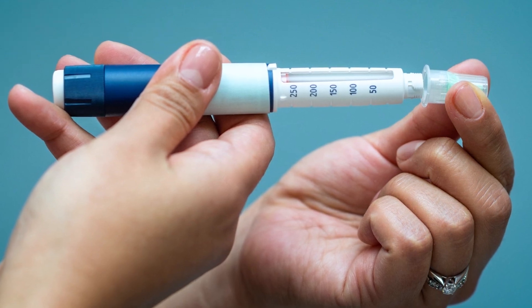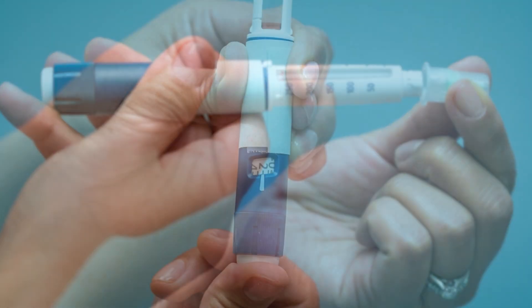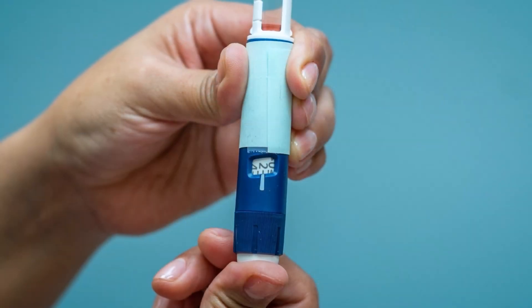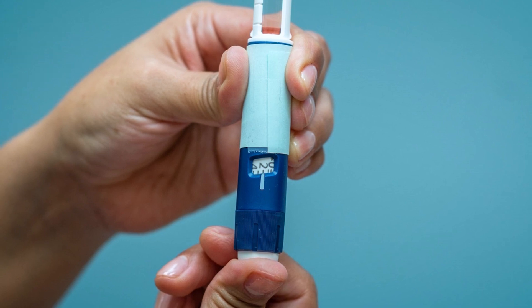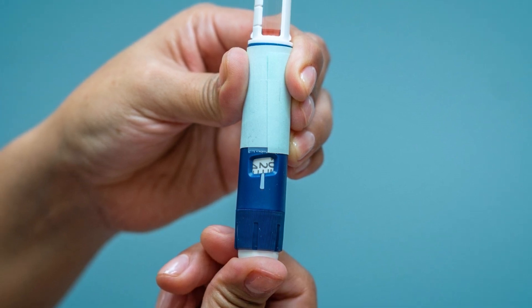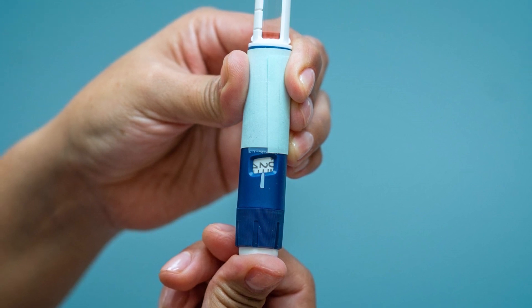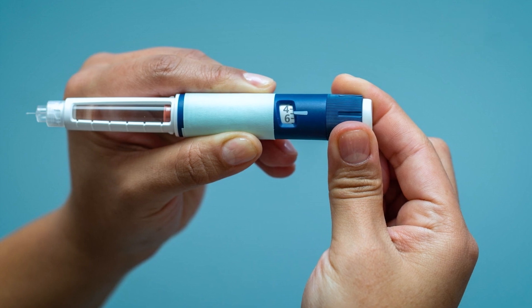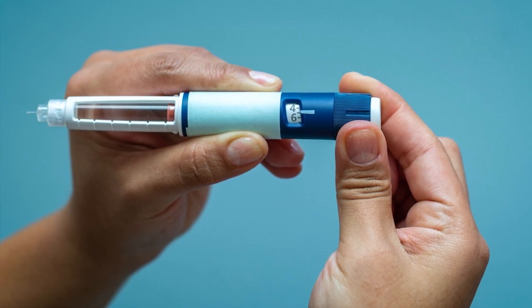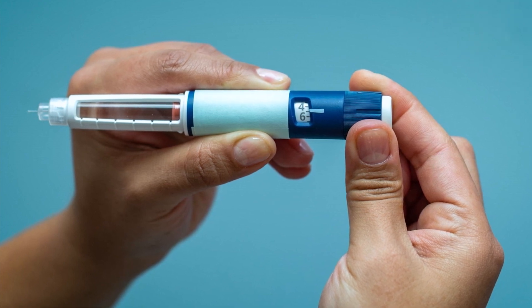Carefully remove the clear outer needle cover and inner needle cover to expose the needle. Step 4: Check the flow of insulin by dialing up to two units and pressing down on the back of the pen until the dial returns to zero. Repeat until insulin drops or a stream of insulin appears. Step 5: Turn the dial to the insulin dose given to you by your provider. Double check the dose window to make sure you have selected the proper dose.